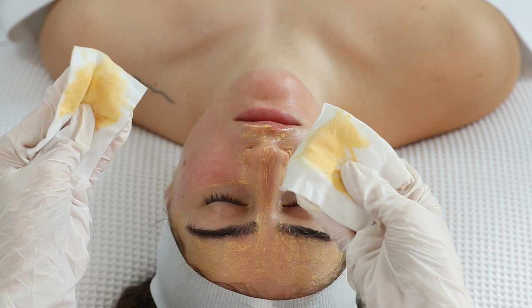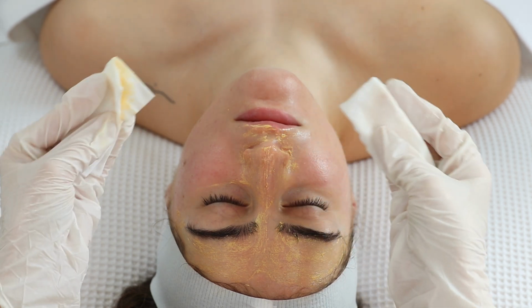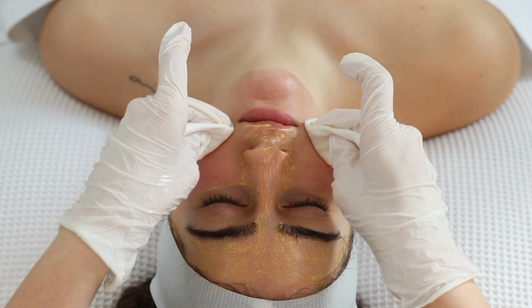Once that is done, you are going to fold the gauzes into half and glide upwards, starting from the chin area, up towards the mouth, then the nose, and lastly forehead.